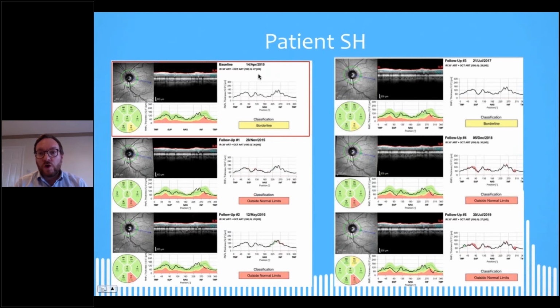So over the course of 15, 16, 17, four and a bit years, we've dropped from 94 to 79 microns. Now, I'm not the quickest at mental arithmetic, but that's a big difference to the 1 to 2 micron change that we would expect. So even if we said 2 microns a year, we'd only expect 8 microns loss over 4 years, and we've got significantly more than that. So what we've got here is this progression change, and that's really, really important.